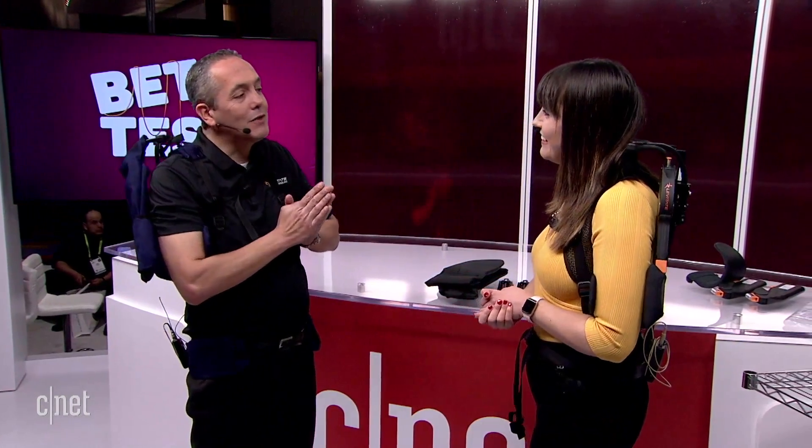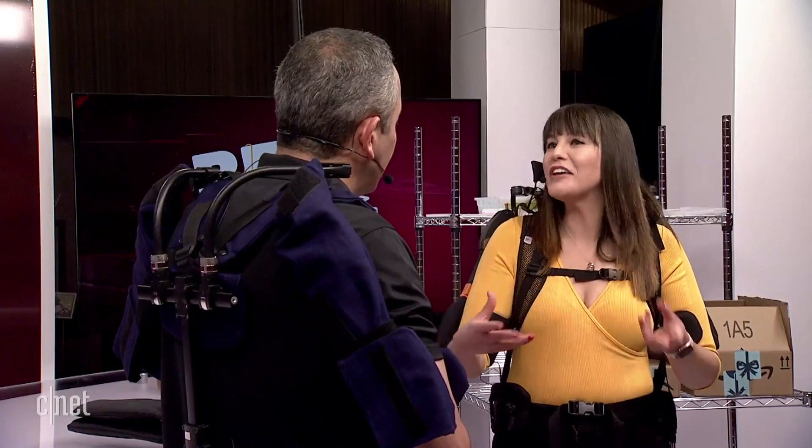Let's talk about price. If I wanted to buy one as an everyday consumer, what are we looking at? We are currently not marketing into the consumer world — we have large companies constantly working with us to do studies, improve the technology, and buying them in large numbers for their workers. It retails at the distributor level for just under $5,000. There is a bulk discount — when we work with a company like Toyota, there's definitely some special pricing. Thank you so much for coming in, Joseph, and showing me all about the Airframe by Levitate.